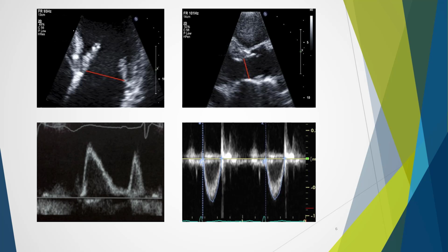A similar process is then applied for the LVOT. Preferably the parasternal long axis is utilized for the LVOT diameter, and again the image is zoomed. Mid-systole is the preferred frame to measure on, and again we can see the leaflets are fully opened here.